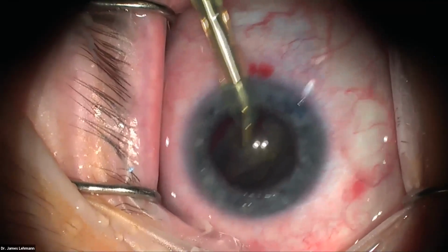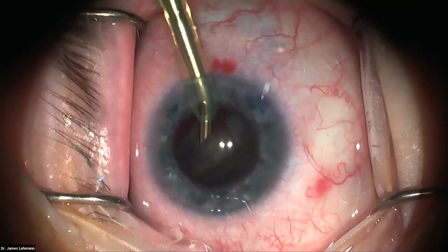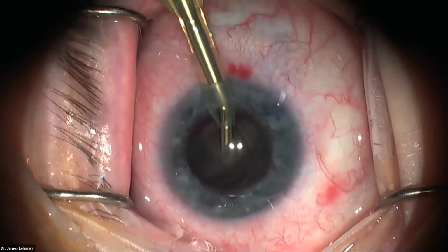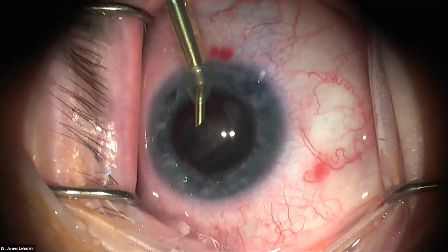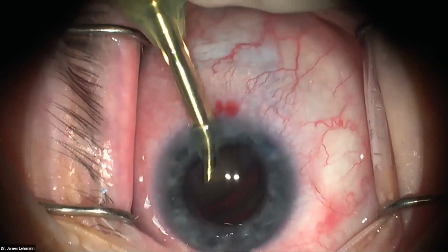I'm going to remove my second instrument to add stability to the chamber, which people think, oh no, how are you going to protect the posterior capsule? Well, with new phaco machines, they have such good fluidics that you're actually doing a disservice by keeping another instrument in, causing water to leak out of the paracentesis. So I'm going to just lift that little part up there.